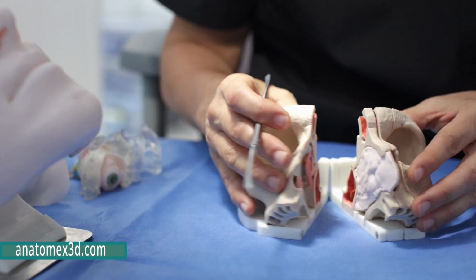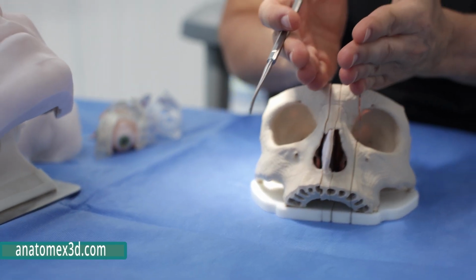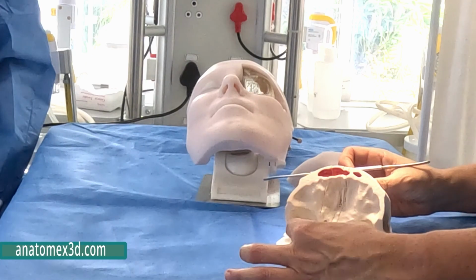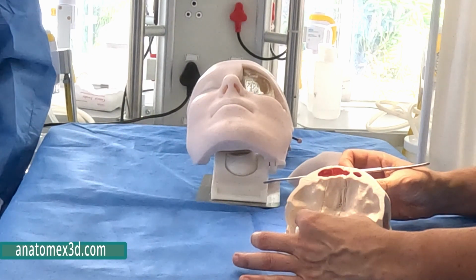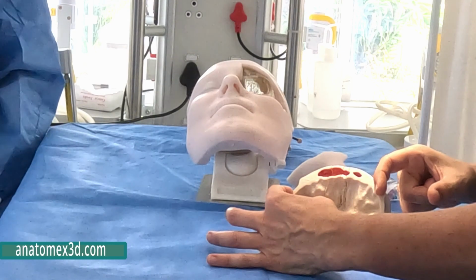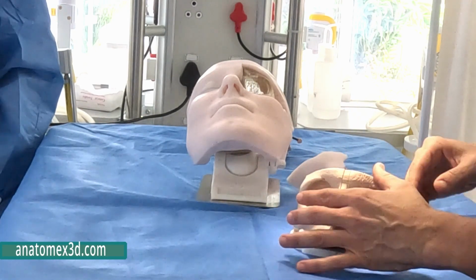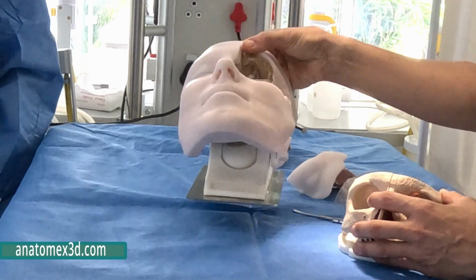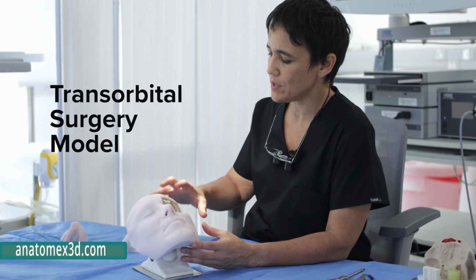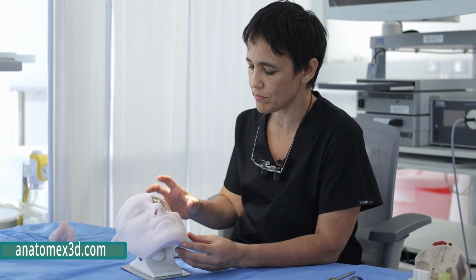So the nasal cavity is really an amazing structure, not just to get to the nose and the sinuses, but also to the middle part of the brain and of the skull. Our problem has been to get to the outer 2/3 of the head, and that's when neurosurgeons have to do a craniotomy, where, if we look at this model, they would make a big cut on the outside of your head to get access to that lateral third, or outer third, of the skull.